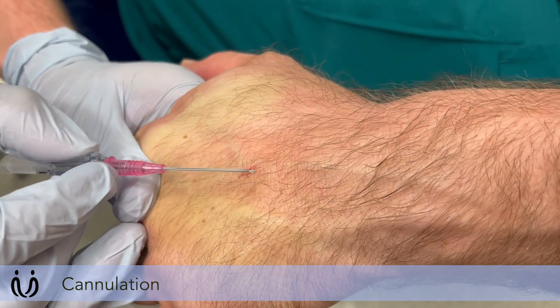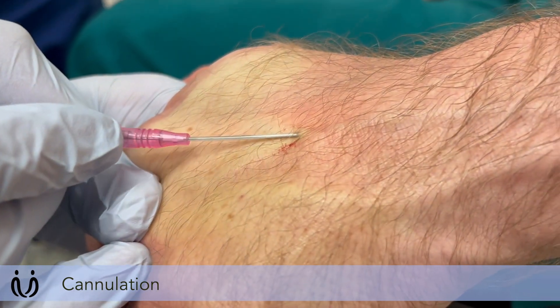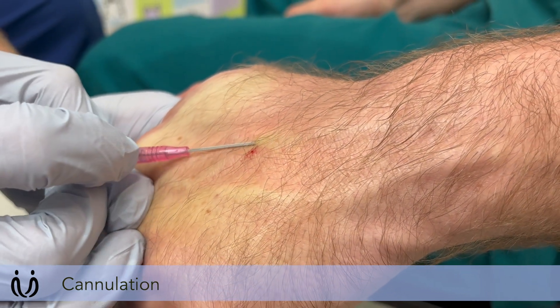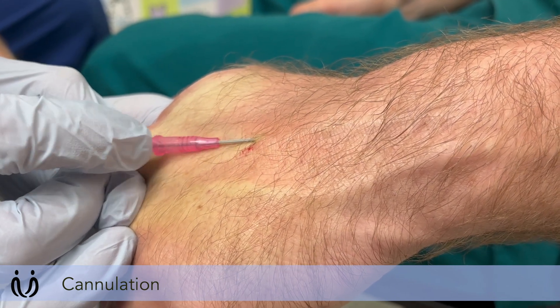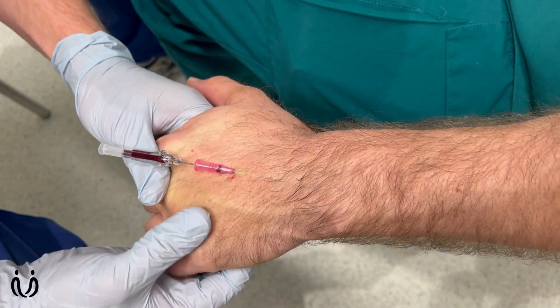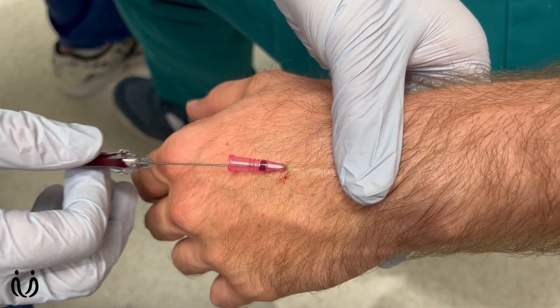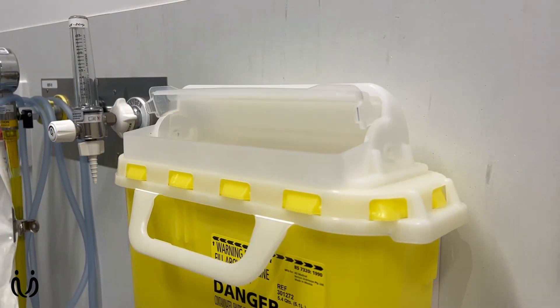Being careful not to touch the same area again, coming in at about a 20 to 30 degree angle. Sometimes it just requires a bit of repositioning. There's some flashback there — advancing the cannula. I'm going to release the tourniquet so it doesn't bleed back too far, place my finger proximal to where the catheter is inside the vein, then remove the sharp and place that in the sharps container.